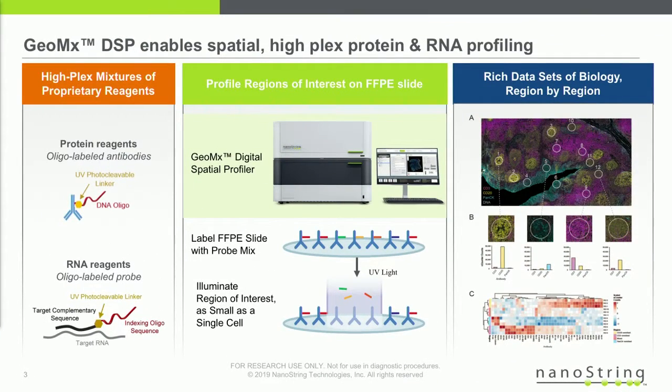The problem we were trying to solve was this: my background is in next generation sequencing, so I'm used to getting 10,000 answers at a time, or some big number. Then I watch people like Sergio come to me with these absolutely gorgeous, precious tissue slices. I put them in a microscope and I get 4 answers, or 8 answers, or 10 answers. I wanted 10,000 or 100,000 answers out of those things.